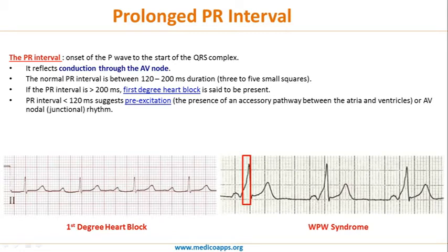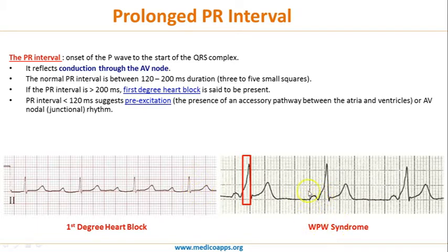Looking at this case, immediately after the P wave the QRS complex is starting — the PR interval is very reduced. More characteristically, there is a slurred uptake of the QRS complex. Normally the QRS complex is very straight and tall, but here there is a slurring. This is also called a delta wave, and this is diagnostic of Wolf-Parkinson-White syndrome, or WPW syndrome.